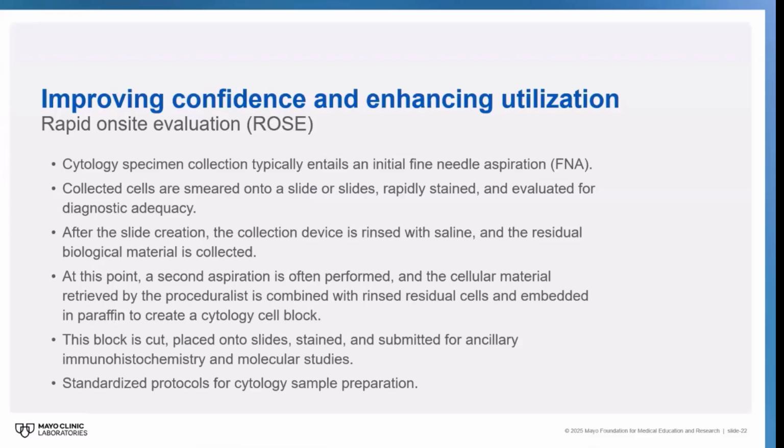So as Dr. Lowe said, we do rapid on-site evaluations at Mayo. We actually have cytotechs going to these procedures. They collect the cytology specimens. They will be using the needles to spread the contents on the slides. We usually smear them. We'll have one spray fixed for later staining with the Papanicolaou stain, while we do a Romanowsky Giemsa stain on the air-dried specimen. We're able to use that slide to help with diagnostic adequacy, in that we can give the proceduralist direct response about whether or not we have enough material, or if we need more passes. They also take that needle and rinse it with saline into a container that we can bring back to the lab to produce a cell block. And that cell block allows us to do some ancillary immunohistochemistry and molecular studies.